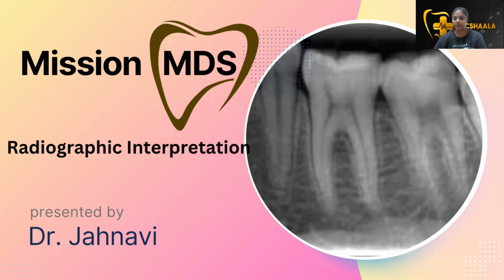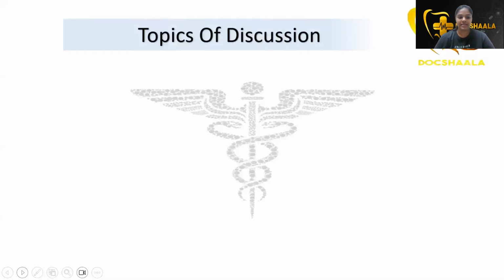So, this is a video on oral radiology rapid revision in which we'll be seeing about radiographic interpretations of various important diseases. In this, I'll be covering a few diseases, and with this, we'll end the oral radiology revision. And the other diseases, I'll discuss along with pathology, medicine, and other topics also. Okay, so let's see what all we can discuss in this.